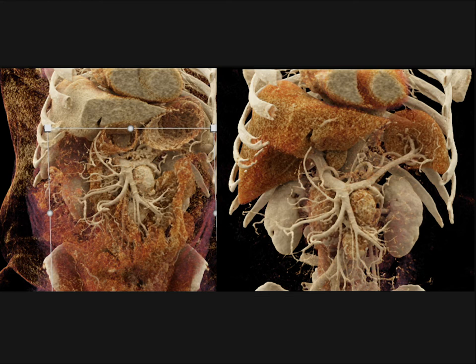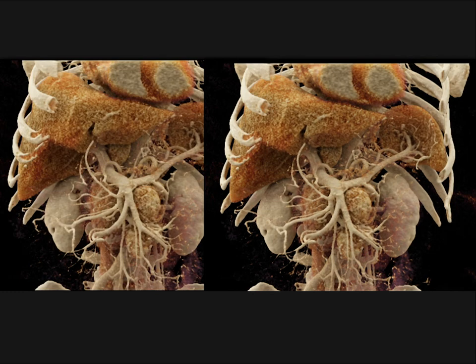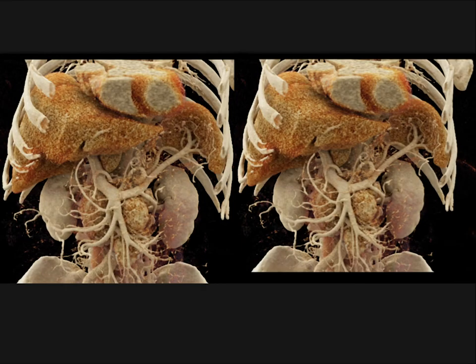And I have been using cinematic. You can see why. Look how nicely the orientation of the vessel is to the tumor. This patient would not be resectable for a number of reasons. But look how large the patient's tumor indeed is. So again, looking also nicely here, the shading of the liver, the spleen, portal vein, splenic vein, SMV, and individual branches, all well defined. And so as you are planning therapy, you can really quantitate the amount of disease. And again, if you're contemplating surgery, that can be used for surgical planning.